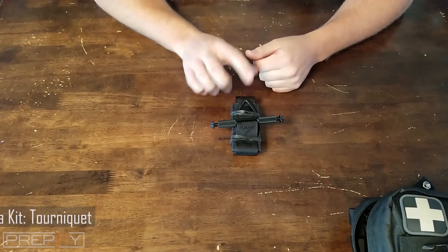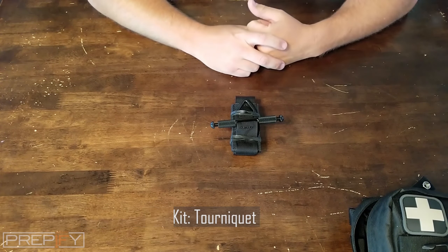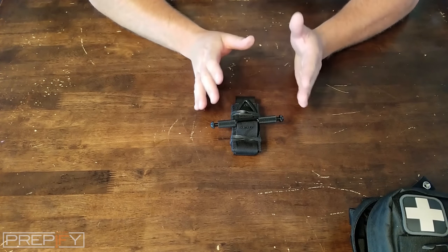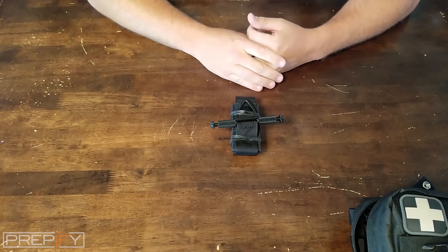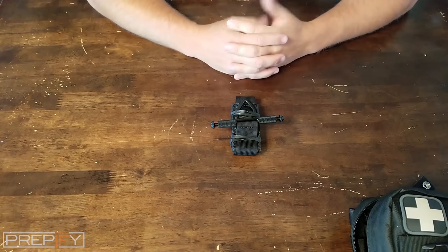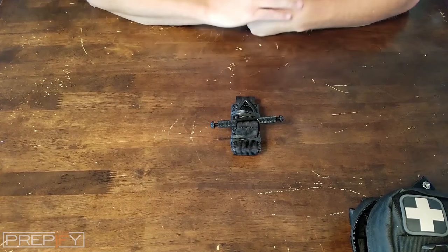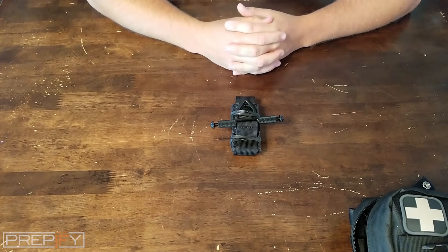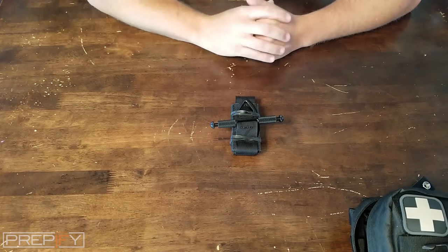We're going to talk about the tourniquet we have here, which was supplied in this Primus kit. If you have the ability to purchase a tourniquet and keep one with you anytime you're out — whether you're hiking or going to the range to shoot — it's a great piece of equipment to have. The one we have here is called a CAT, a Combat Applied Tourniquet, a great piece of equipment that most military personnel carry.